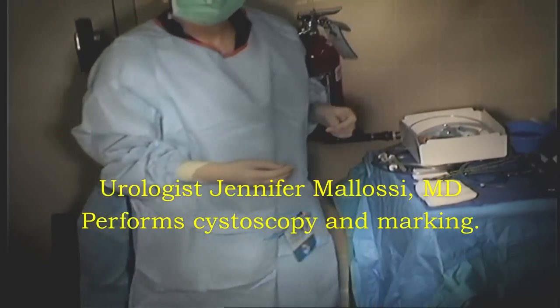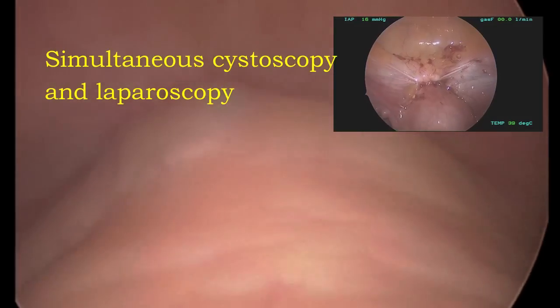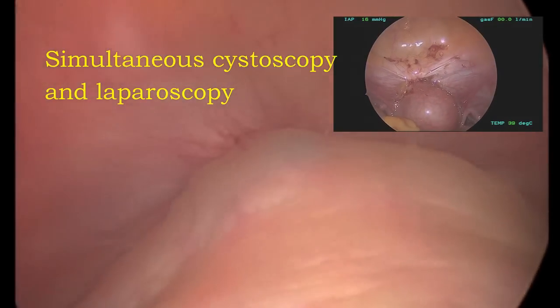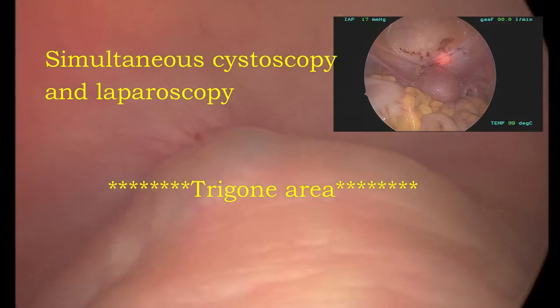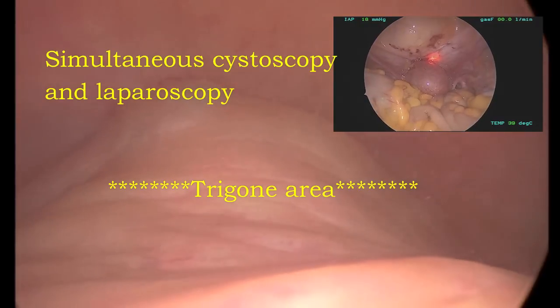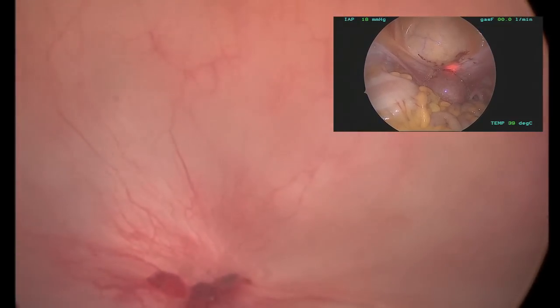The urologist will then do a cystoscopy and utilize cystoscopic marking. A simultaneous laparoscopy and cystoscopy is performed, and here you can see the lesion through the cystoscopy view. The trigone is identified, and then ureteral stents will be inserted so that the surgeon knows where the trigone is at all times during the procedure.